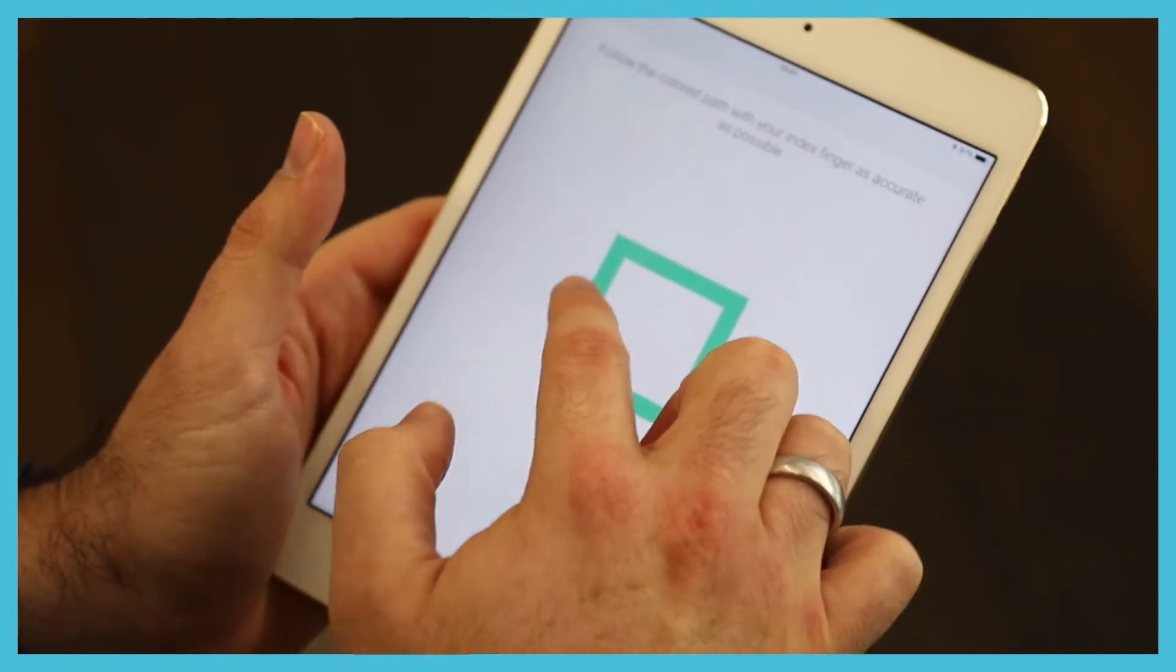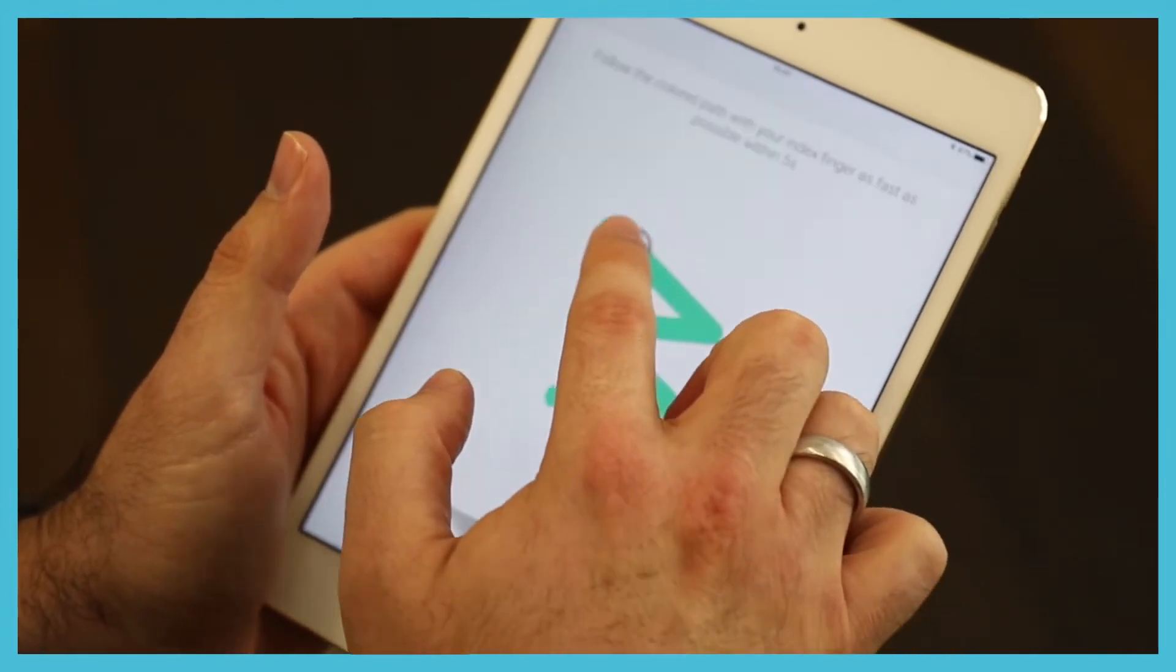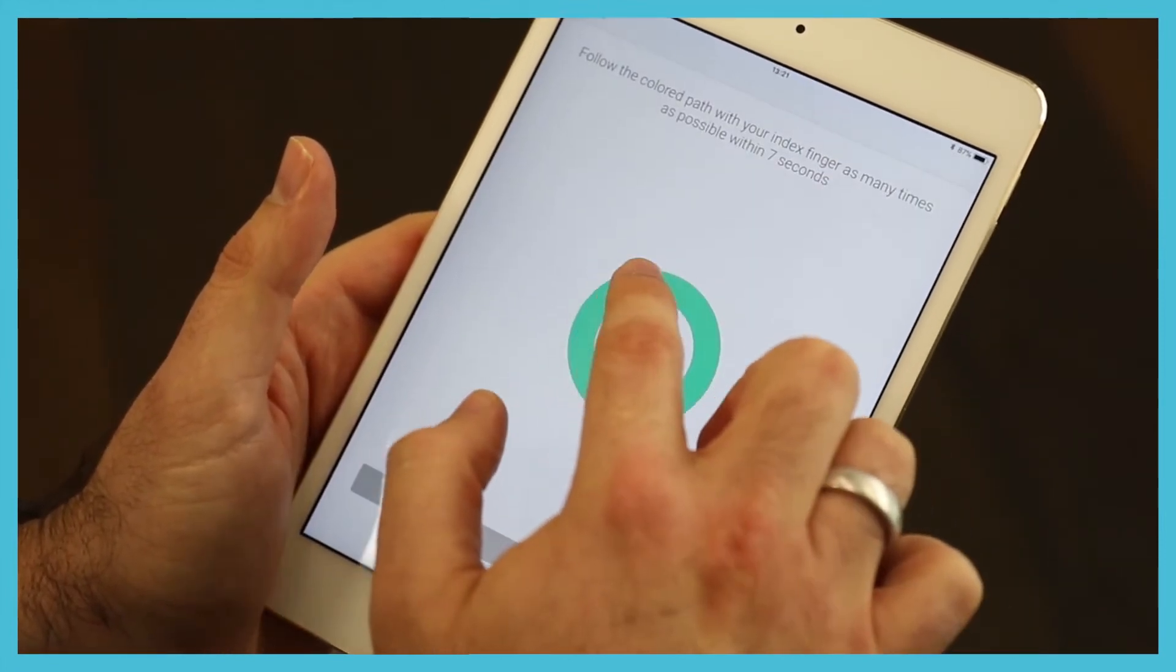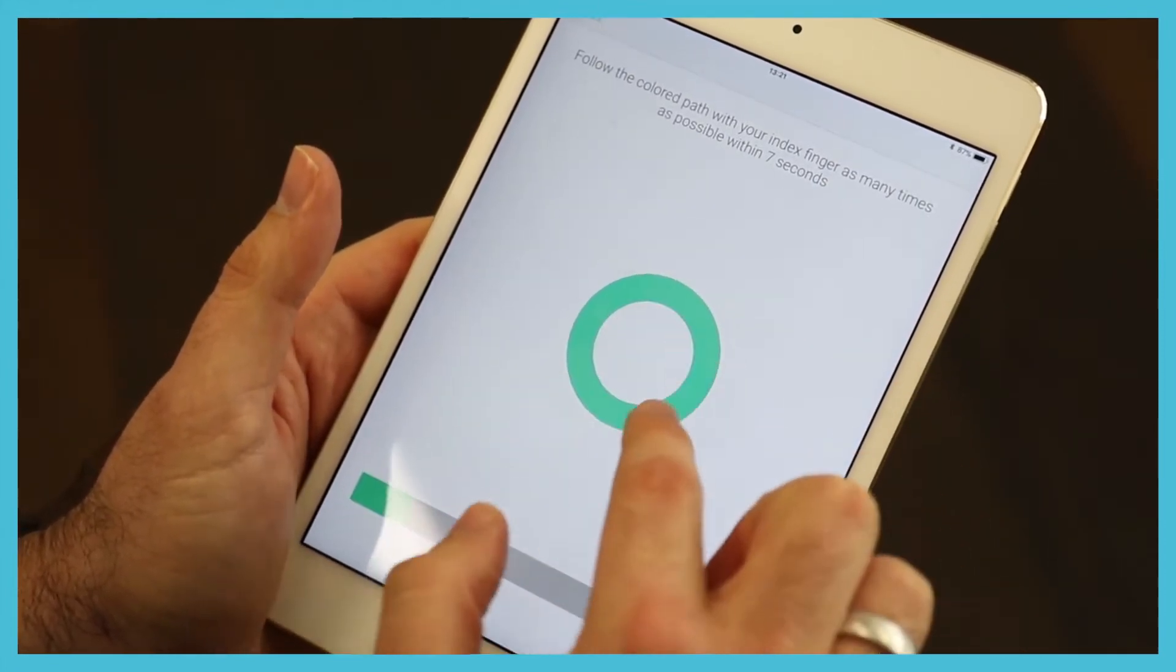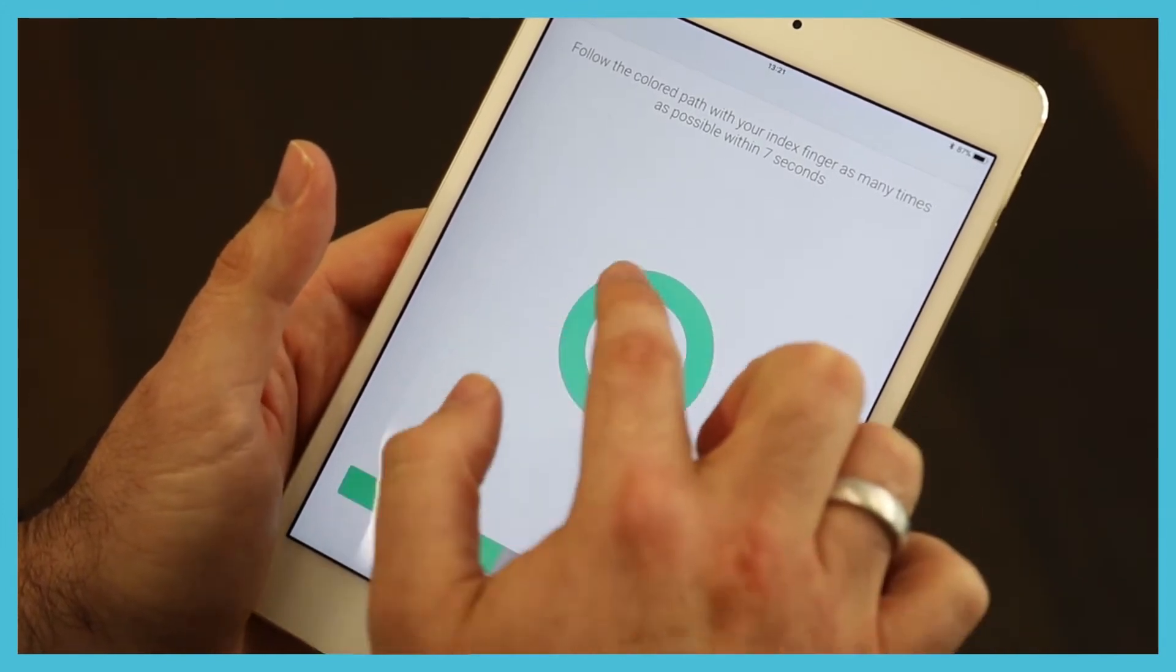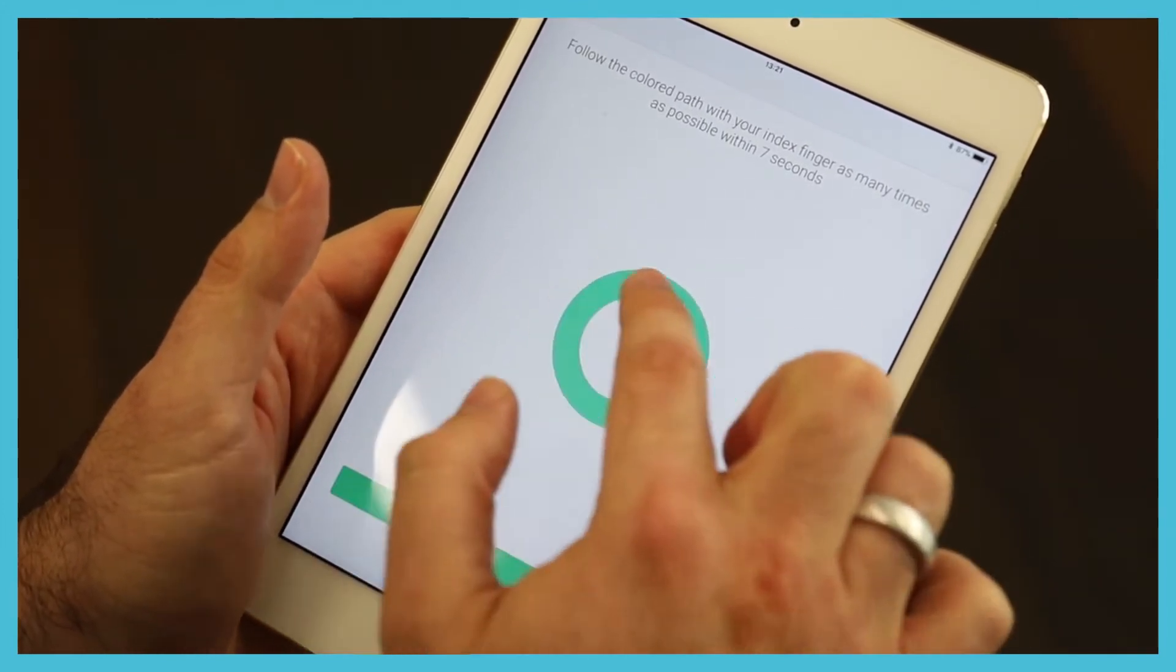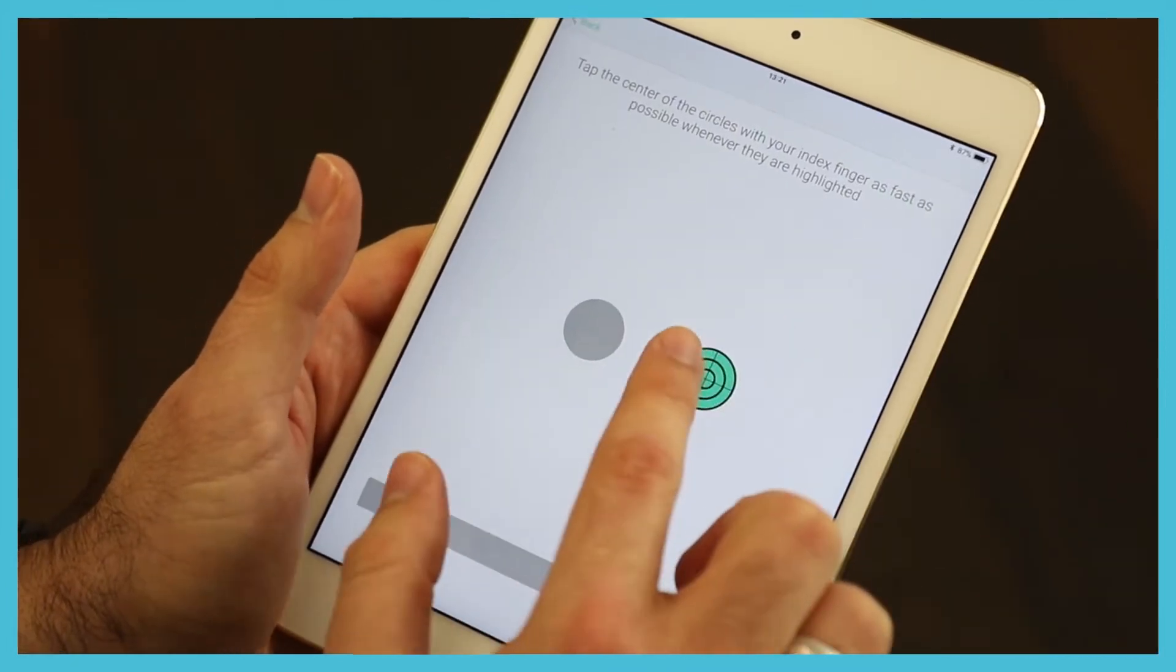I'm being measured continuously, so everything that I do here, the way that I hold my iPad, the force that I'm putting at completing the task and my errors are being documented. Am I inside the circle, am I outside the circle?